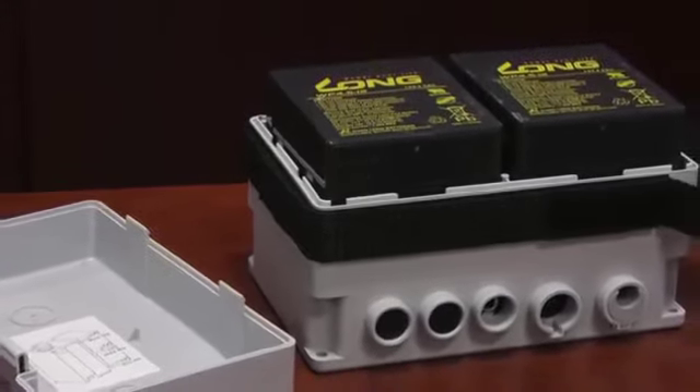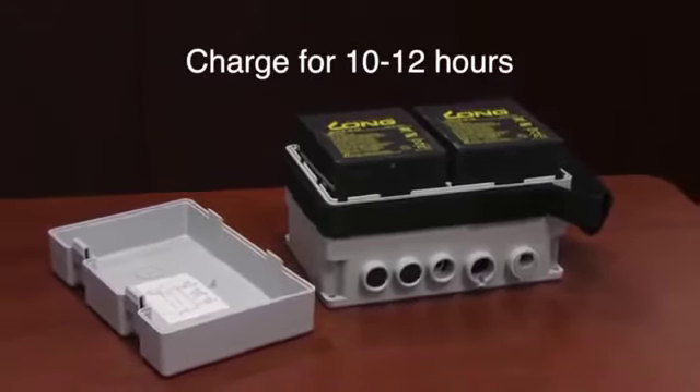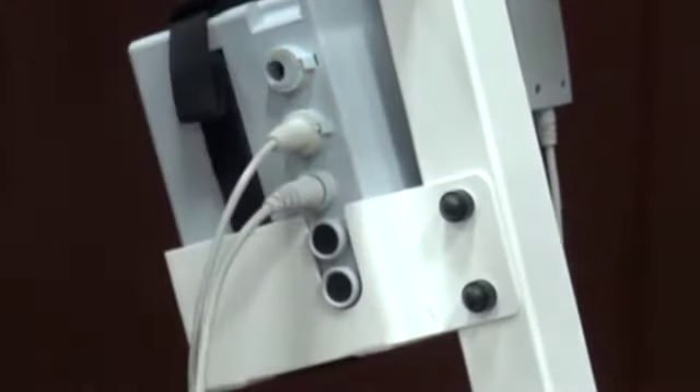Charging the LF 2020 and LF 2090: the control box holds two 12-volt batteries and a PC board. Your new lift should be charged before using. The LF 2020 and LF 2090 should initially be charged for 10 to 12 hours. There are five openings on the control box: the actuator motor plugs into the third opening, the hand pendant plugs into the second opening.